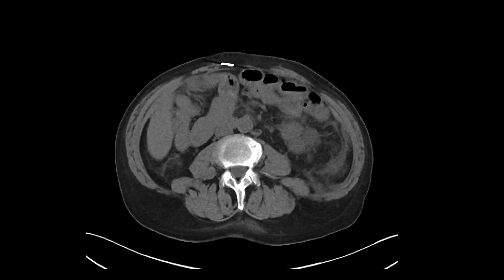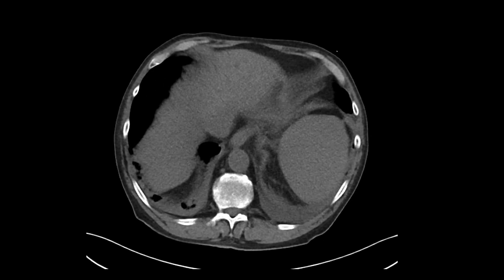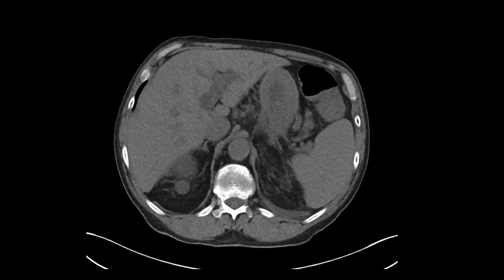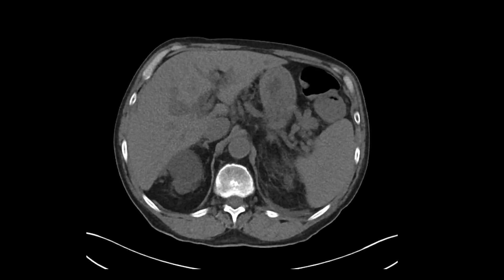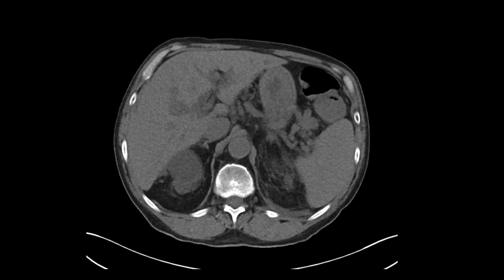The reason I wanted to show this case is that if you look at everything else systematically, you'll see that the bile ducts are dilated. The intrahepatic biliary tree is definitely dilated — you can see it next to the portal veins. Sometimes it's tough to see on non-contrast CT scans, but if you go ahead and look for it, you'll see it.